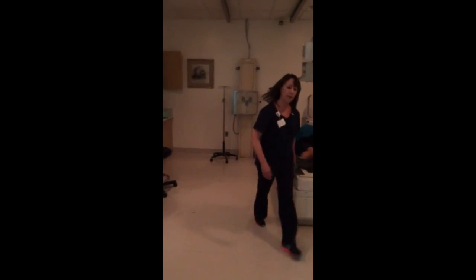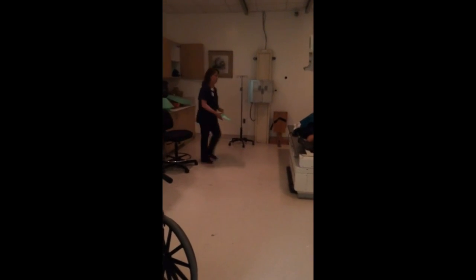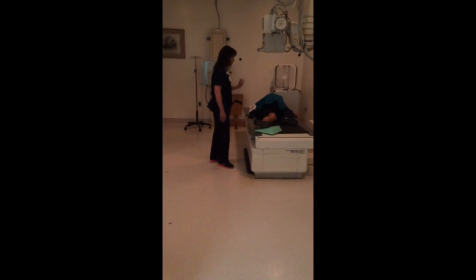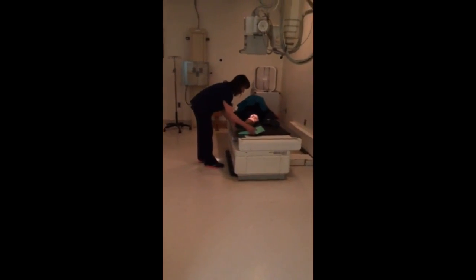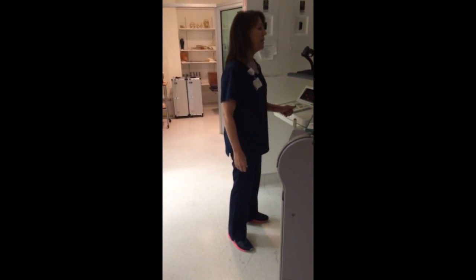Real still for me. All right, again, my technique is 70 at 5 mAs for my lateral view. I do want to place my sponge underneath the toes. I want to make sure that my epicondyle... real still for me. X-ray.